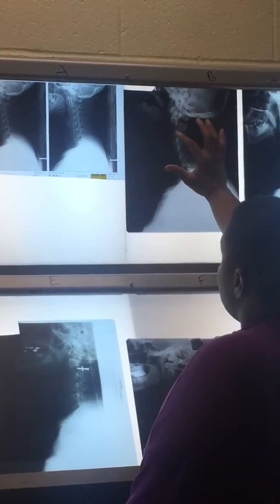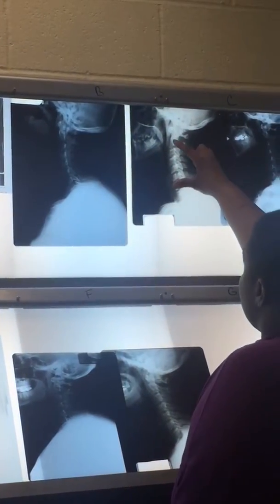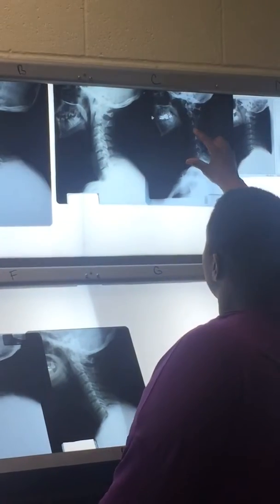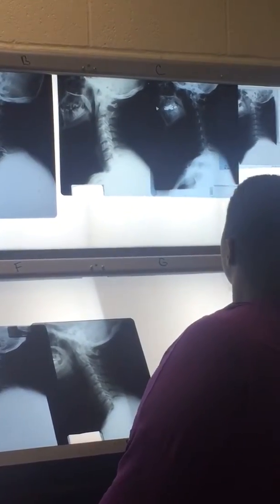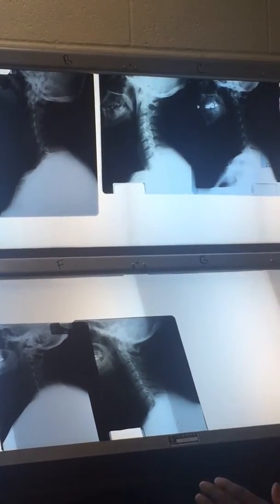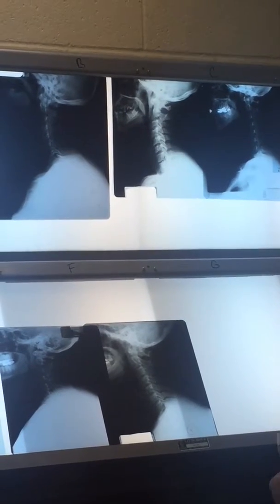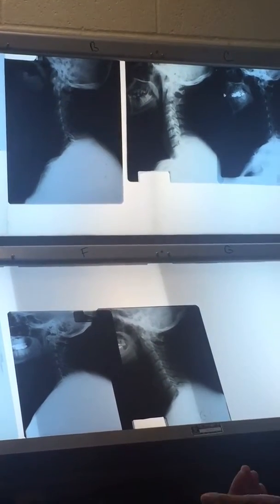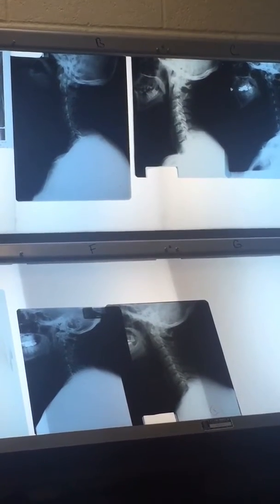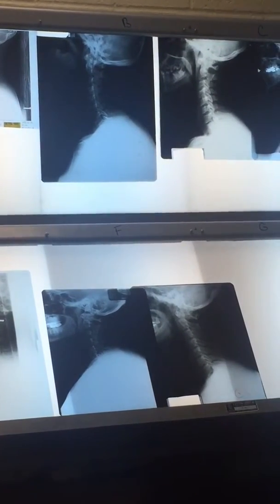That's basically what you want to make sure you see on any given C-spine position. If you don't get T1, or you get less than that, and you tried at least a few times and pulled the shoulder and did everything, then of course the swimmers is your last resort, which we'll talk about in a little bit.